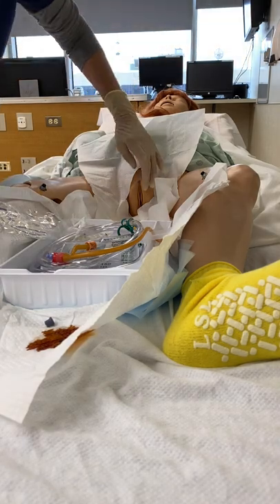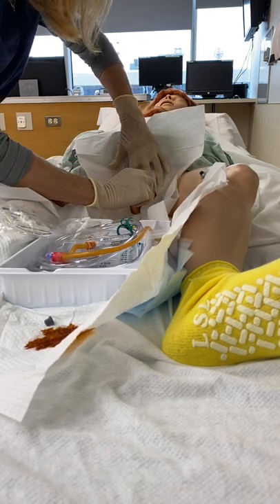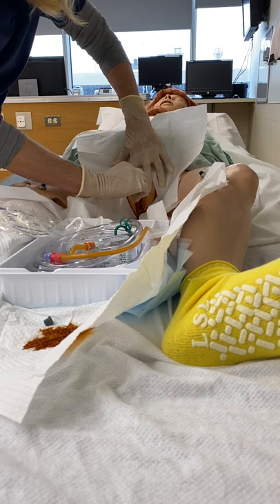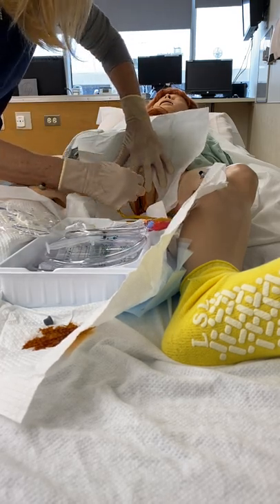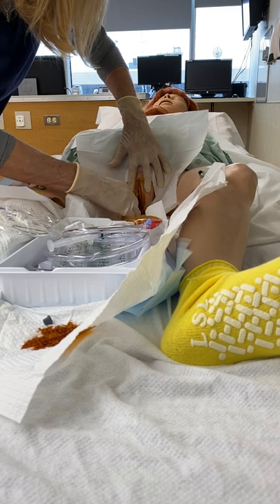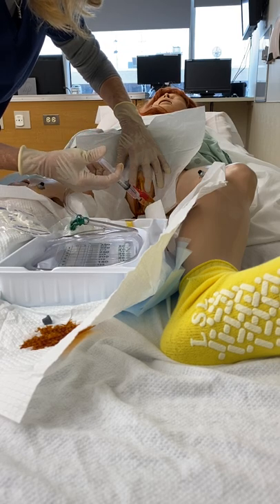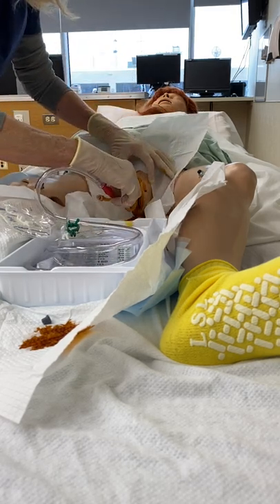Now it's time to insert the Foley. I'm going to open her labia, take the betadine, and wash on the right-hand side from top to bottom — throw it right in the garbage, not back on your sterile field. Left side. Then down the middle. Okay Lulu, you're going to feel a little sting. This is well lubricated. I'm going to place this right in her urethra, being careful not to touch my hands to the urethra. Put it in as far as you can. Grab the water tube — that's filling up the balloon. Release it. I'm going to gently pull on this just a little bit to make sure it's in.